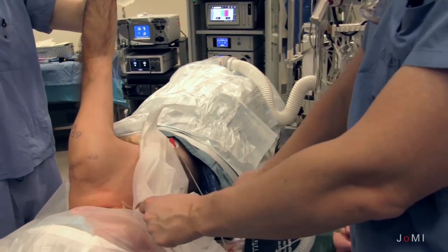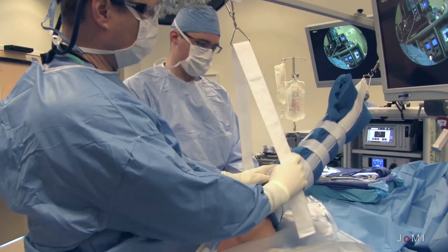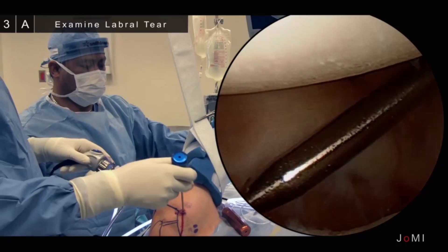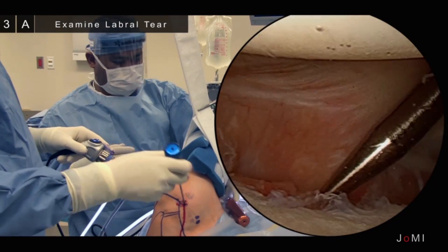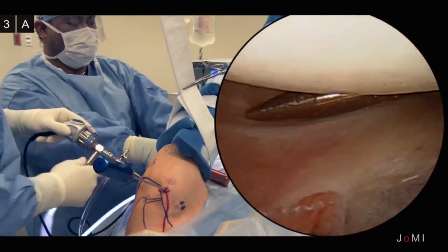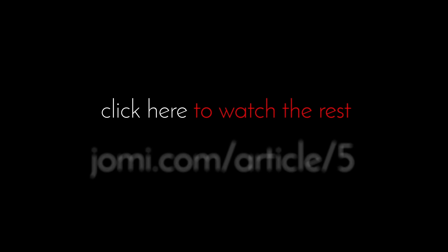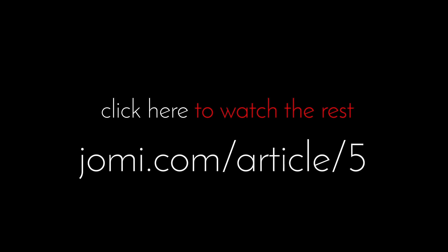As you can see here, we're using a bean bag and arm holder to help position the patient. The next step is to confirm our patient and our surgical timeout. Once this is done, we start with our diagnostic arthroscopy. We perform a very comprehensive arthroscopy looking at all of the structures in the shoulder both from anterior and posterior. Following this, we then switch the arthroscope to the anterior-superior point.